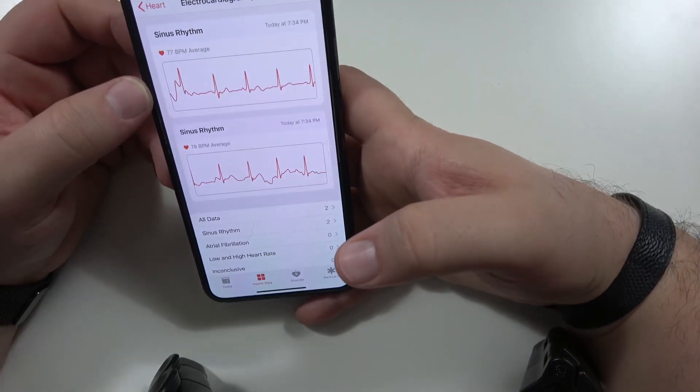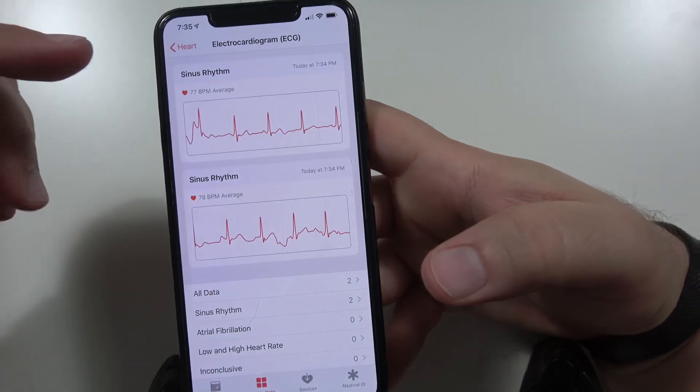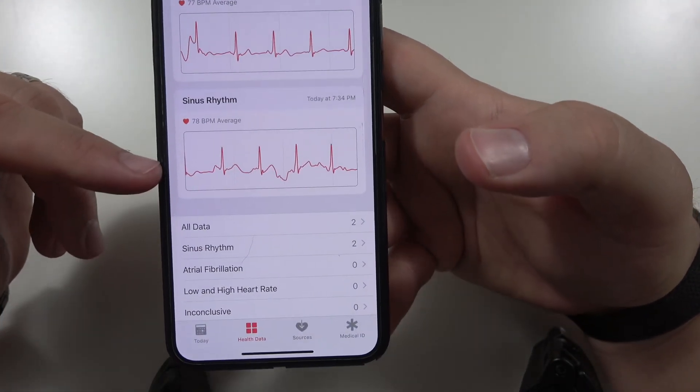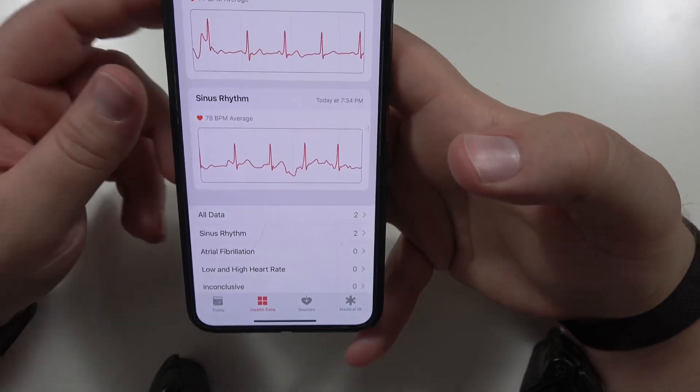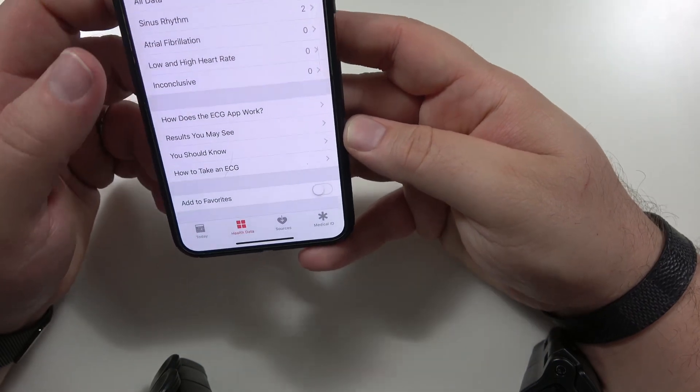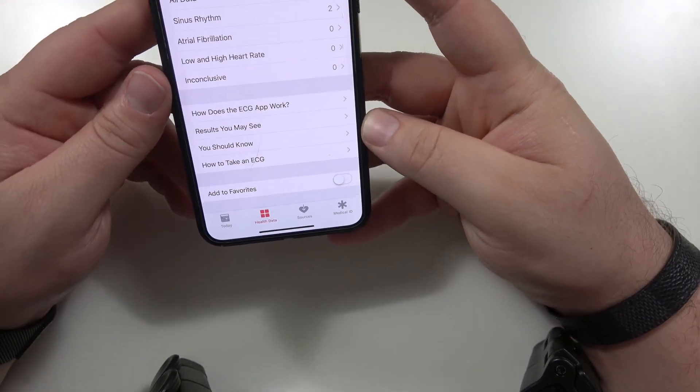My health data immediately came right over. We've got the one I took, back to back. One I was at 78, the other I was at 77. So I think I'm good to say that I am not in atrial fibrillation at the moment. How amazing is this for everybody who has an Apple Watch Series 4? It can not only help detect falls, it can help detect if your heart isn't working correctly.